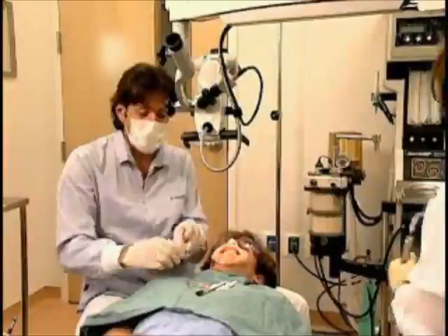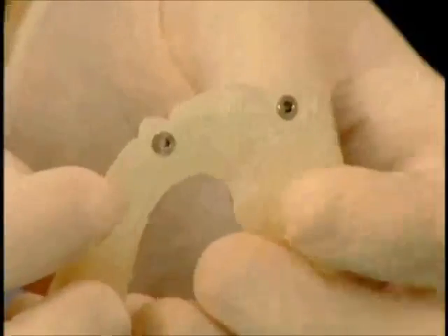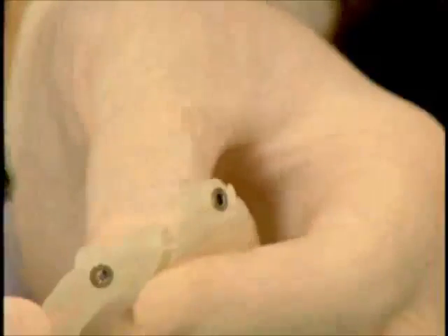On the other hand, we took an opportunity to cut a section of a surgical guide, and these guides were made off of the CAT scan to coordinate with the replacement of those 2 lateral incisors. I split it at the midline to give you an idea of what that would look like when placed in the mouth. This is what we have. Chin down a little bit.